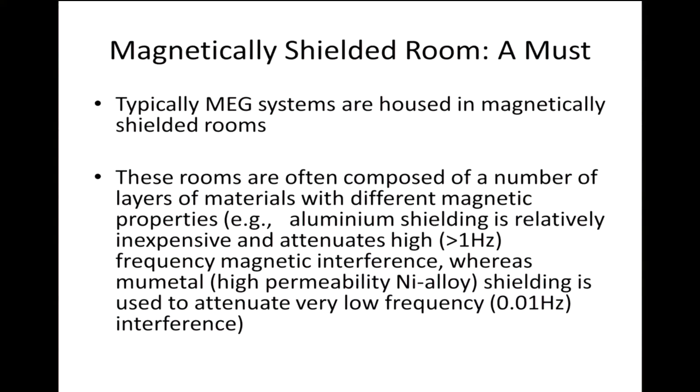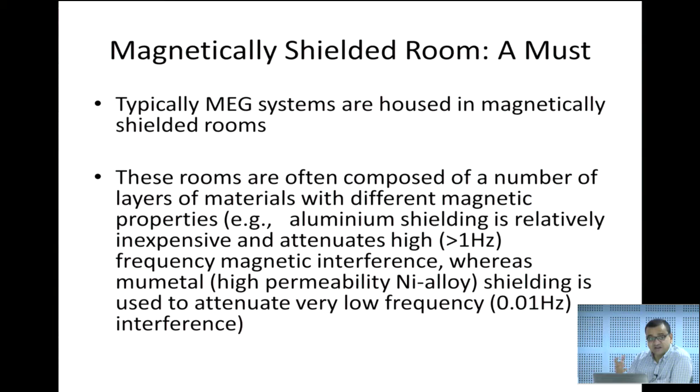In hospital settings, because MEG is so expensive, it's primarily set up, even abroad, in established clinical settings, because it's too expensive to maintain. You can buy it, but just to maintain it, hospitals possibly have the resources to allocate. So in clinical settings, they have different requirements for this magnetic shielding room, MSR as we call it.